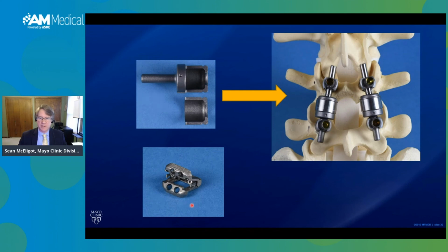The spine fixation device: Dr. Brett Friedman conceived an idea for a cervical fixation device to assist in anterior cervical fusion of the spine. It's adjustable where currently they have to pick a particular angle and size. This one would be adjustable so that they can make it patient specific. And this prototype version includes 2 adjustment screws to adjust the angle to fit the patient-specific anatomy.